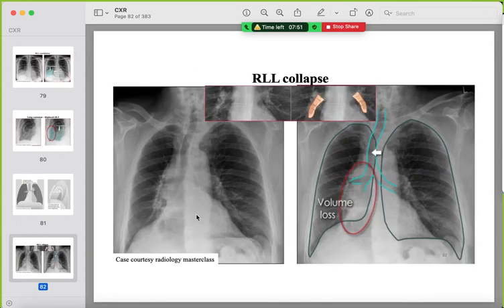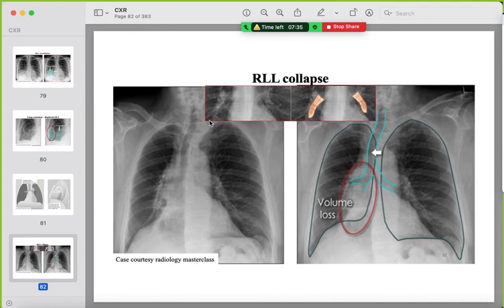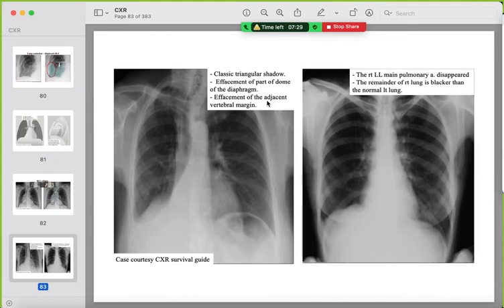Example of right lower lobe collapse: triangular opacity, the medial end of the right hemidiaphragm is not clearly seen, the right hilum is pulled down, and the right lower lobe pulmonary artery is not seen. If both right heart border and right hemidiaphragm are not completely seen, this represents combined right middle and right lower lobe collapse due to obstruction of the bronchus intermedius.